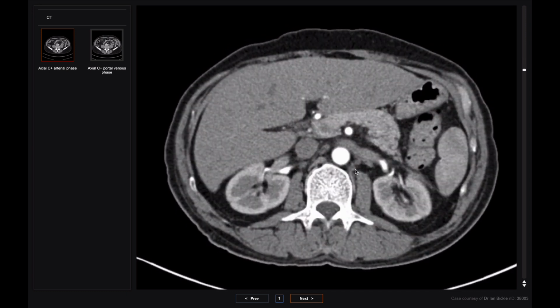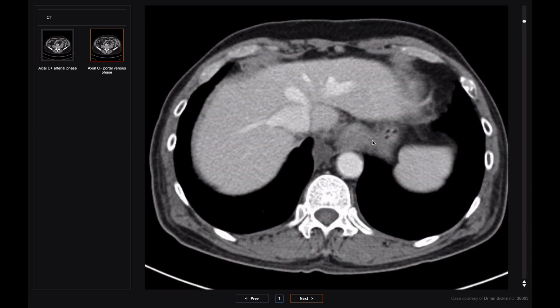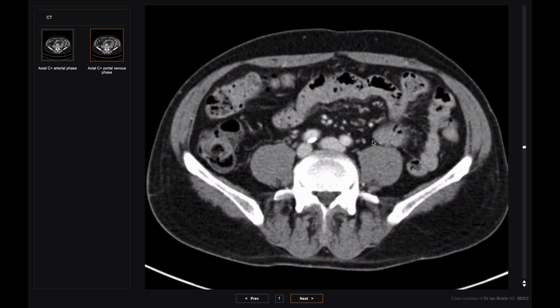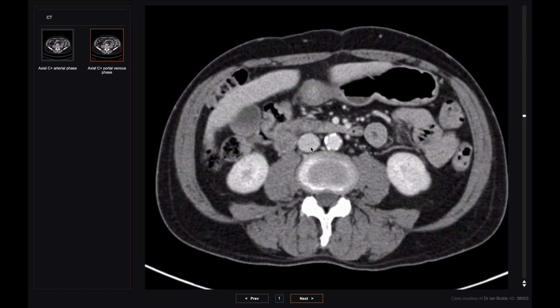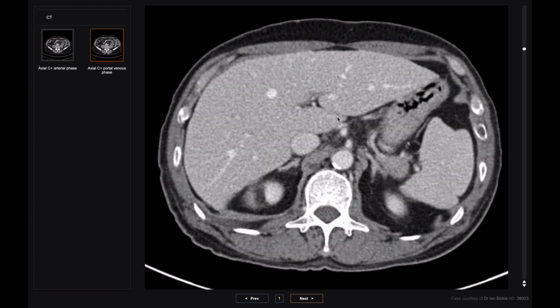Now, if we were to then hit go on the scanner again at approximately 70 seconds, so that's 70 from the time of the contrast injection, then the contrast has had time to go through the tissues of the lower limbs and back into the systemic venous system. And so it's in the iliac veins and in the inferior vena cava, which is just here, and also make its way through the bowel and then into the mesenteric venous system, and then from there into the portal venous system.